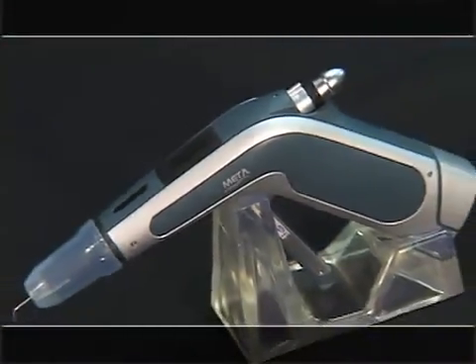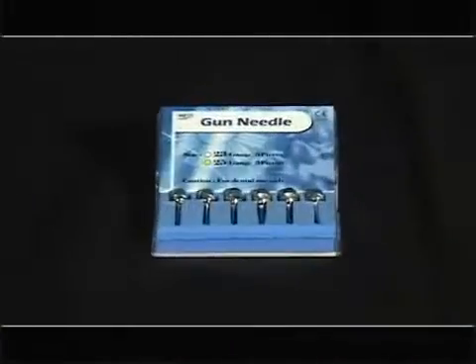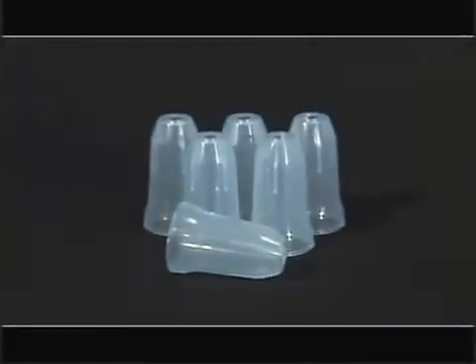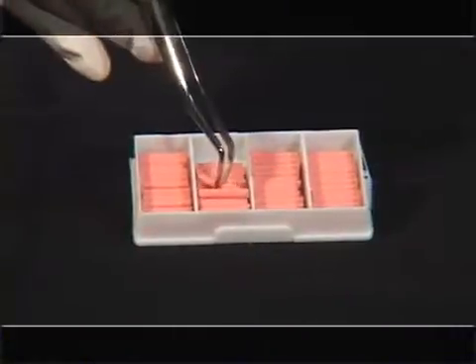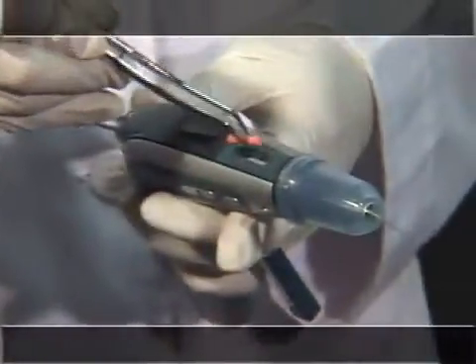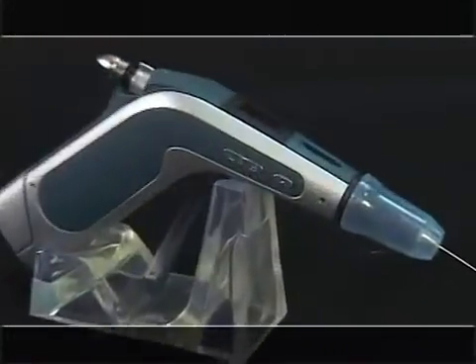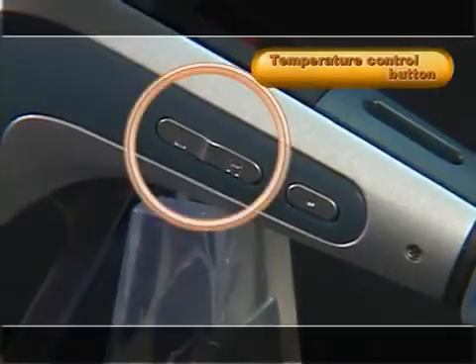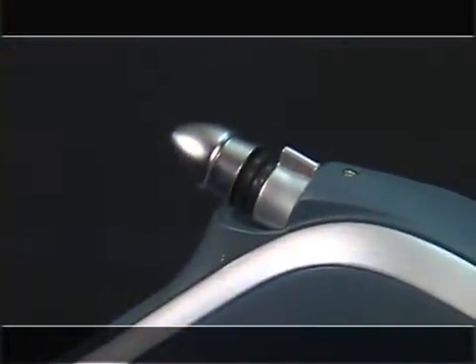These are the key functions of the Master Gun. The needle is where softened Gutta-Percha bar is pulled out. The heat insulator protects from burning when using the gun. Insert only one Gutta-Percha bar into the slot. The power switch and temperature control button can adjust temperature from 50 degrees Celsius to 200 degrees Celsius. The plunger lever is used when you put it out or insert it.